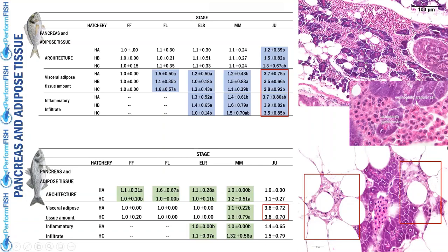In this image, you can see the infiltration by acidophilic granulocytes. And in the other picture, we can see a particular lesion.